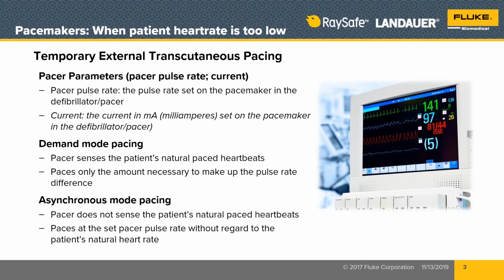Just want to make it clear that we're not testing implanted devices, so not implanted defibrillators nor implanted pacemakers. When we do quality assurance testing, periodic testing on these medical devices, we purposely do not want the patient connected. We're going to connect our test instruments instead and do everything that needs to be done to verify the performance and safety of these devices. So just to make that really, really clear. For some reason, people just don't like us discharging the defibrillators that are implanted in their chest. I don't know why. Yeah, that's true.